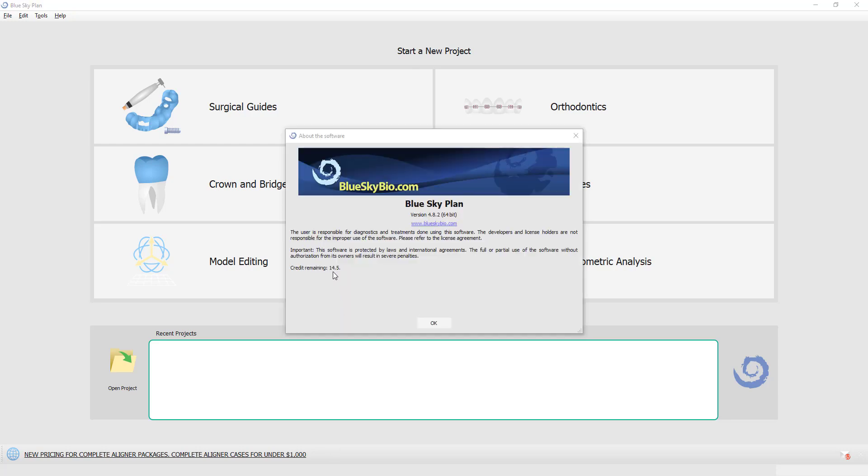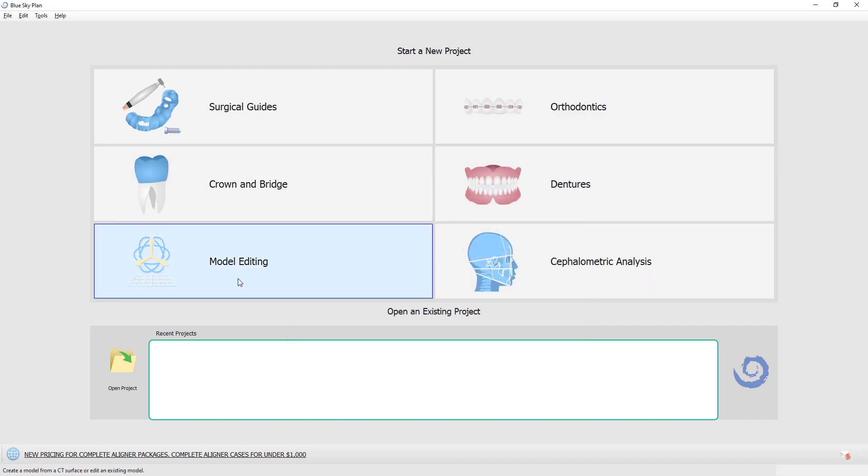I'm going to show how the process can be done at no cost. We have 14.5 credits remaining right now and let's check this out.